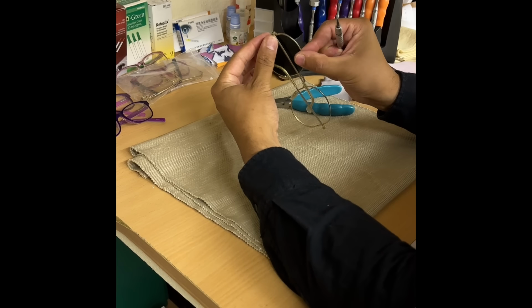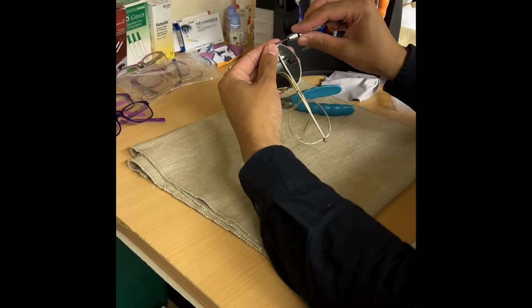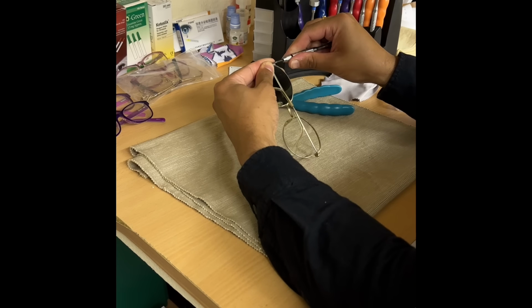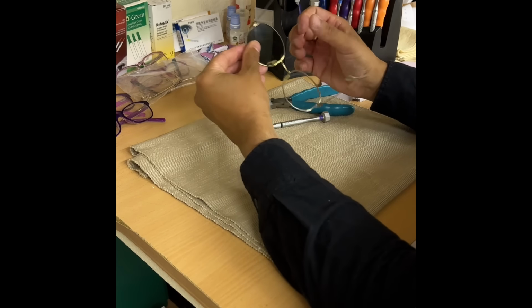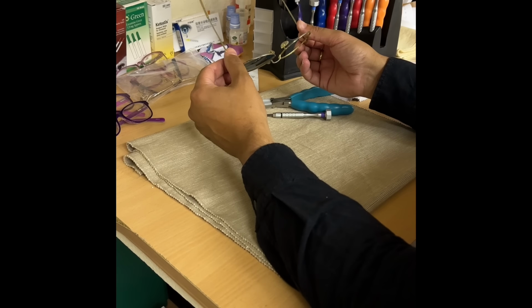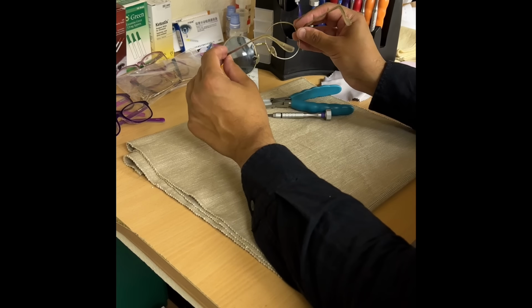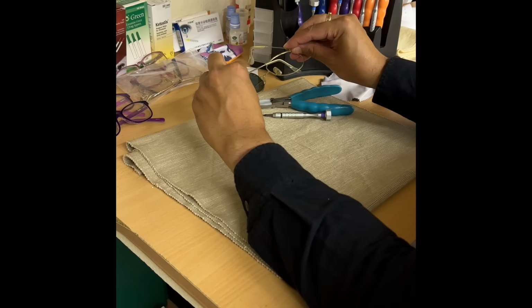Yeah, the thread is intact there. I'll just loosen off the lens joint there so that we can get this one out more easily to replace it. Okay, so they're looking more levelled off. We'll replace both lenses for you. Leave that one with me.